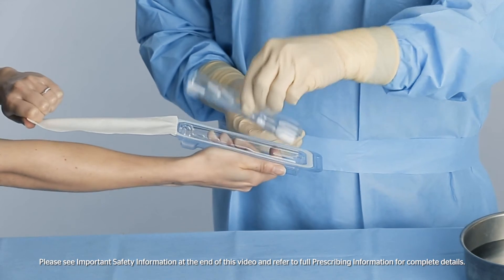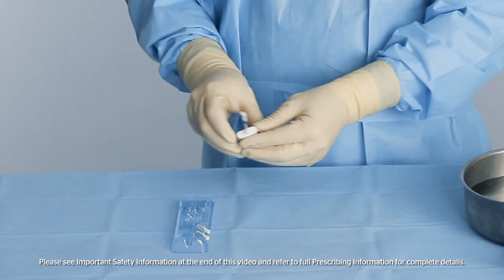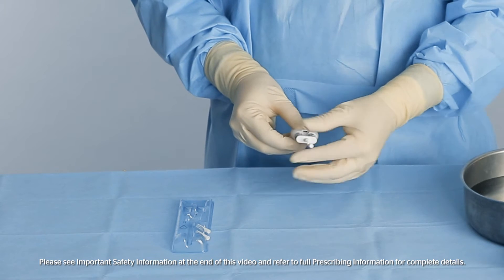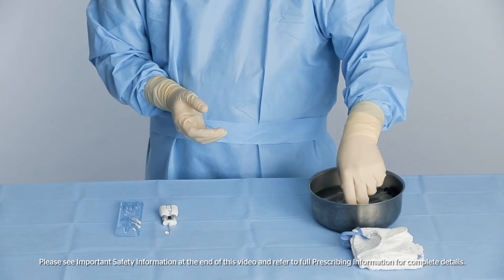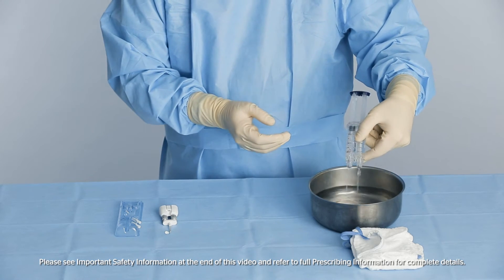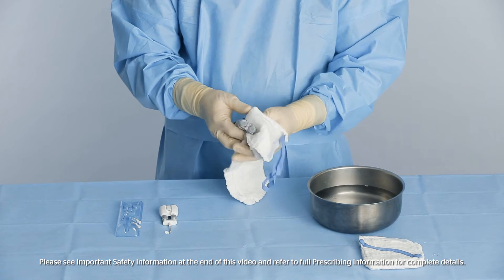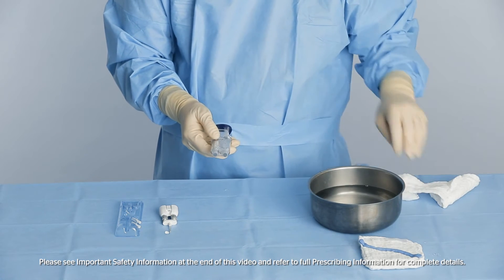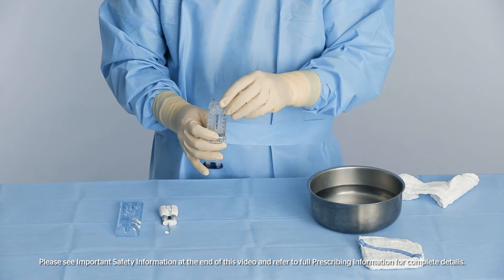Open the blister pack containing the airless spray accessory. The malleable dual-lumen tip can be bent into the desired position and will retain its shape. Unscrew and discard the lure caps, making sure to keep the syringe holder upright.